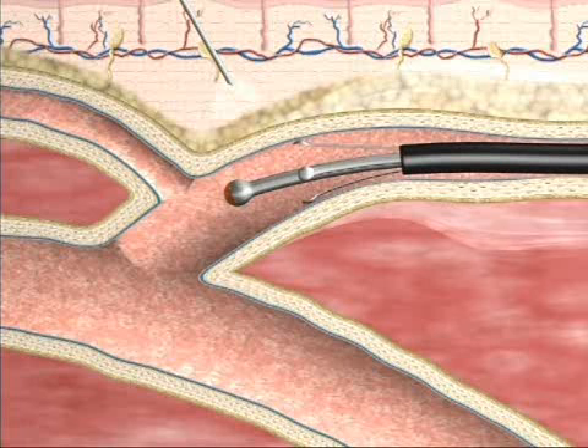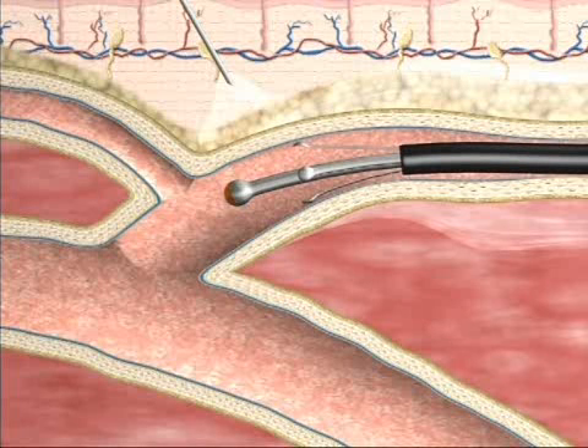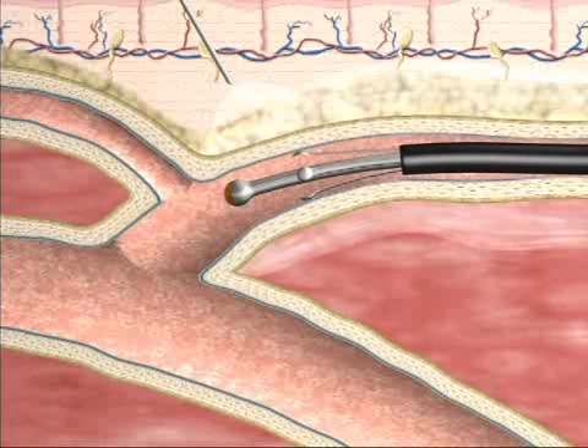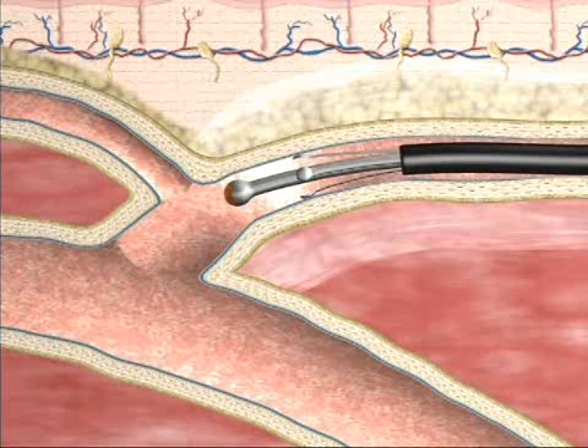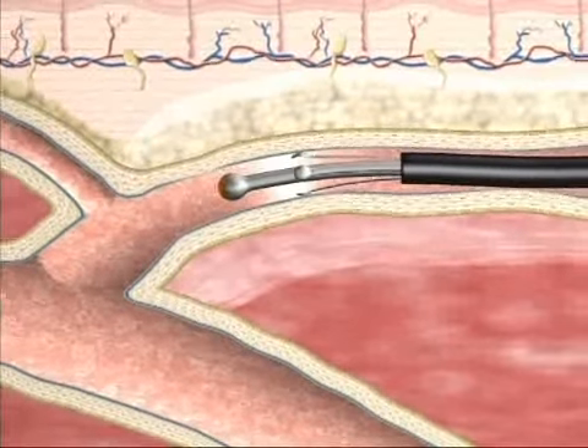Tumescent anesthesia is injected up the vein into the saphenous compartment to provide skin protection, exsanguination, and compression of the vein onto the electrodes. RF energy is turned on and pullback begins.